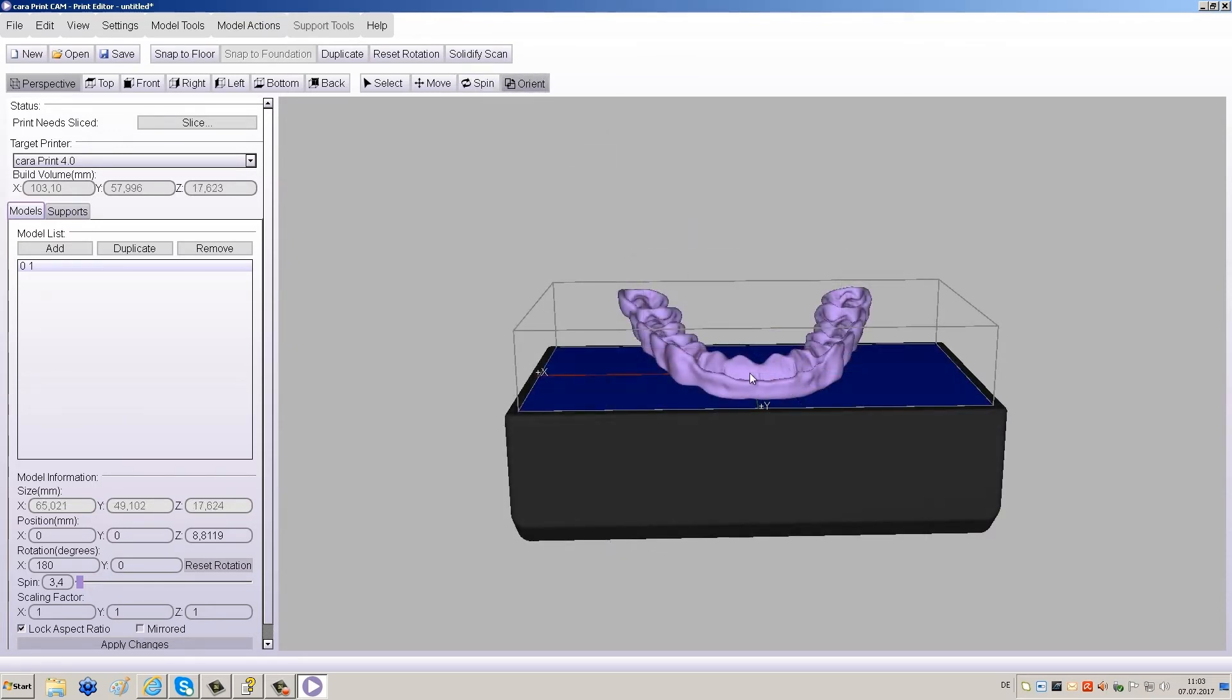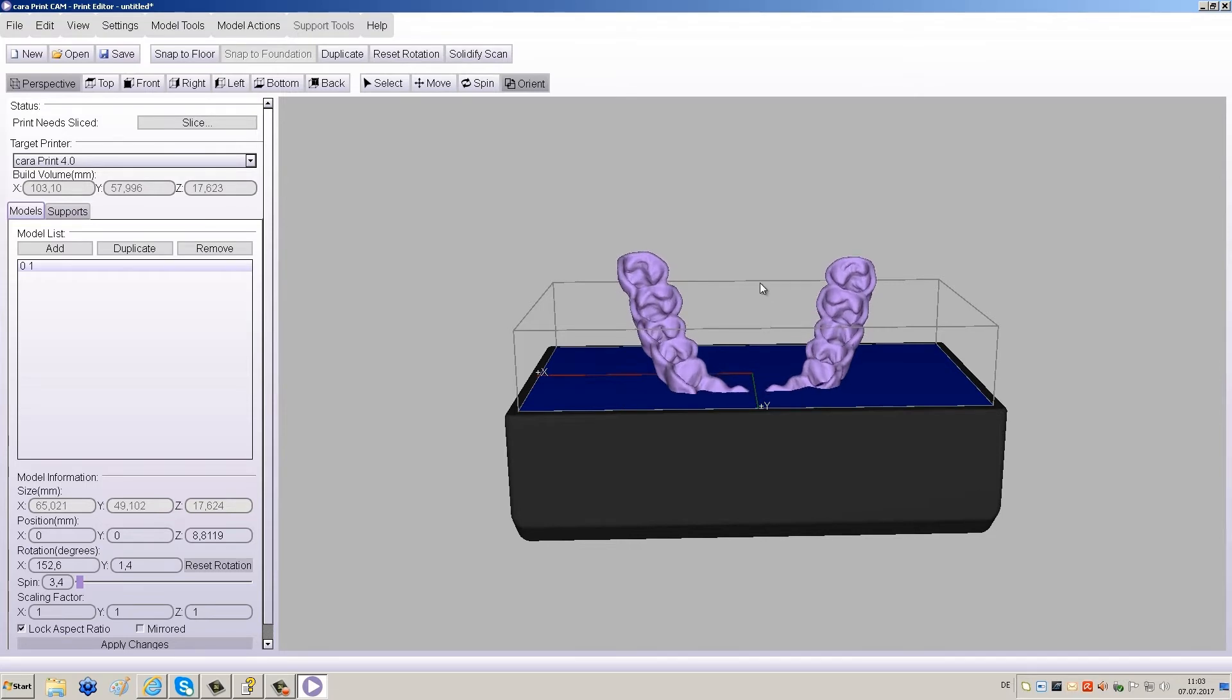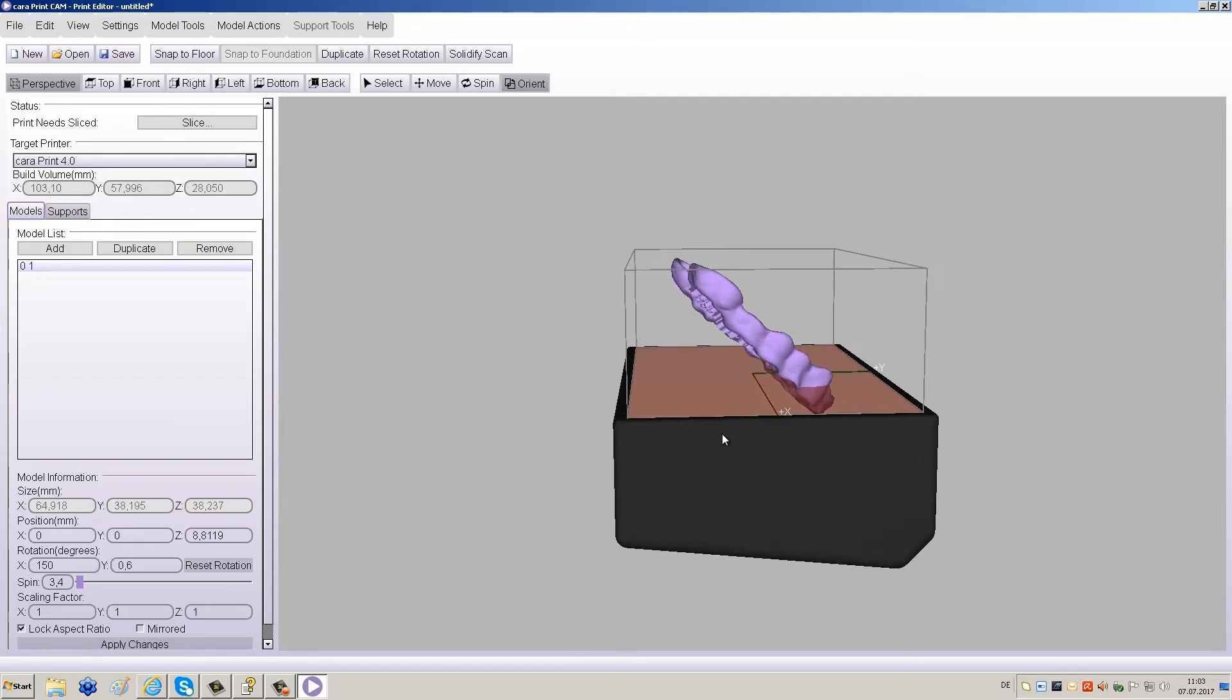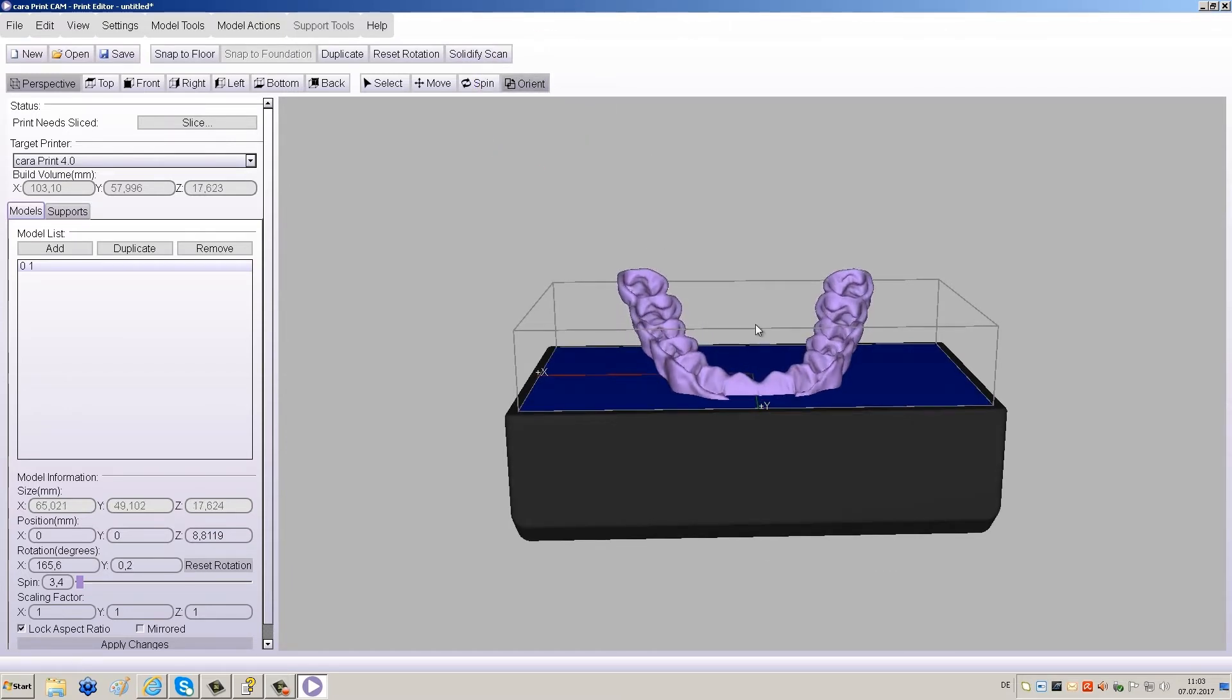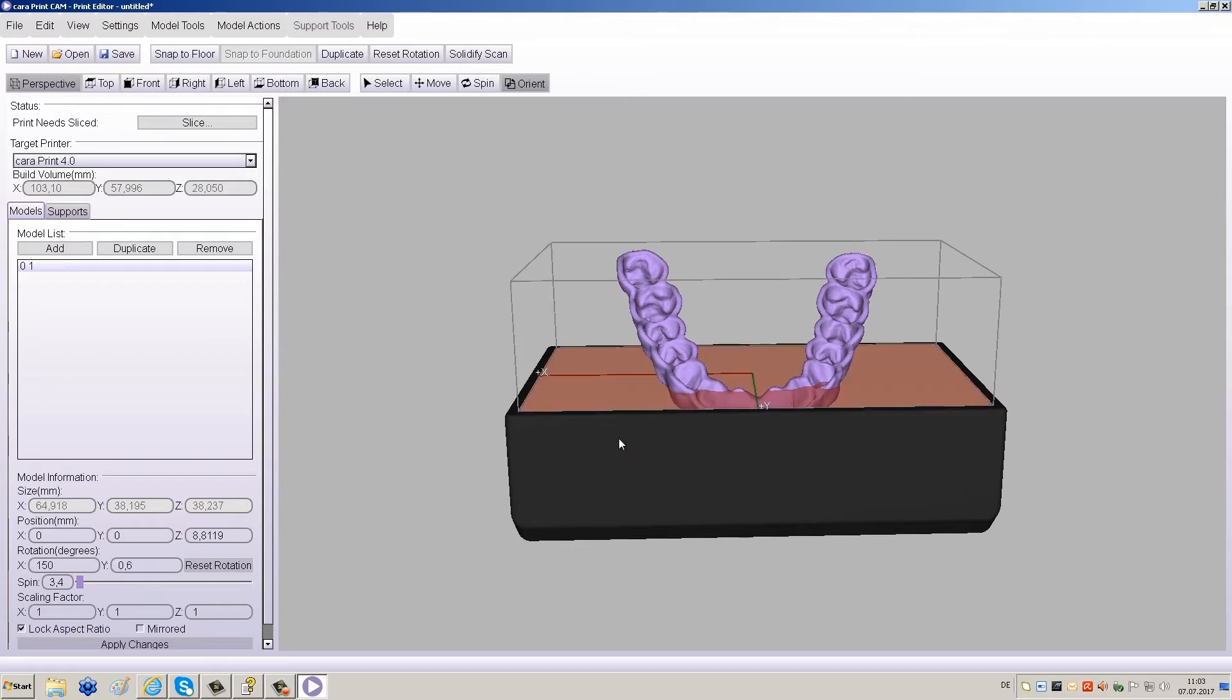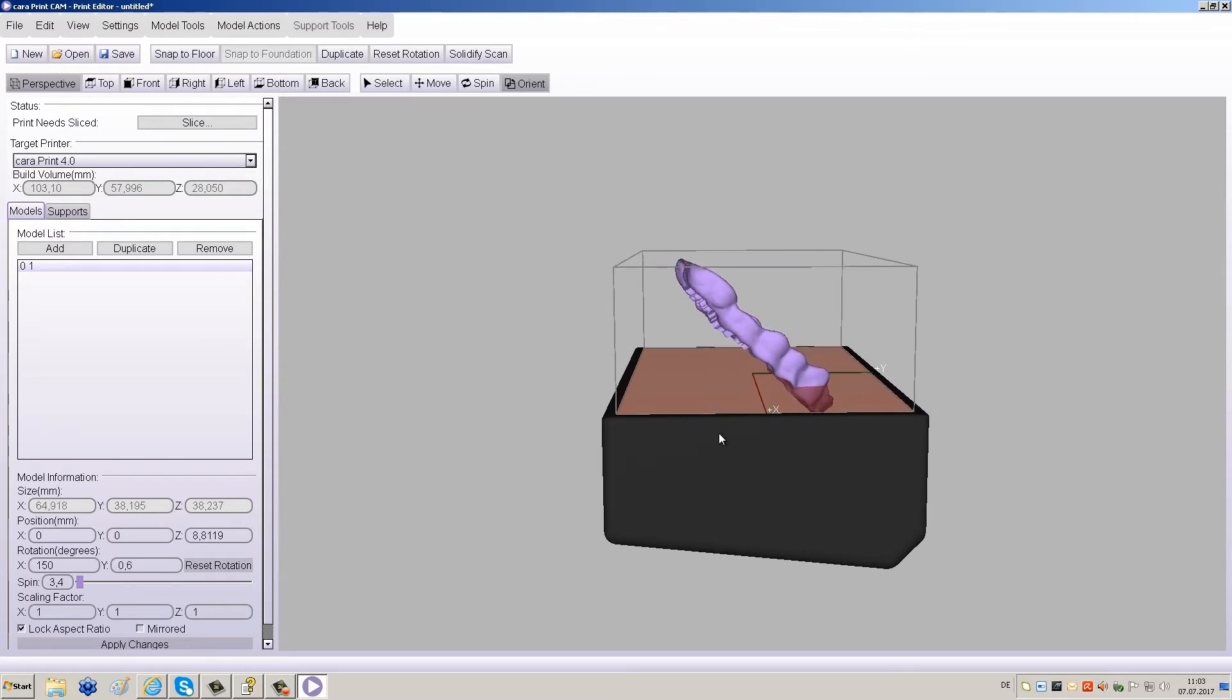When orienting the object, the surfaces that are most important for a good fit should be facing away from the build table. You can optimize the supporting structure also by slightly adjusting the orientation. Remember, we are building layer by layer.